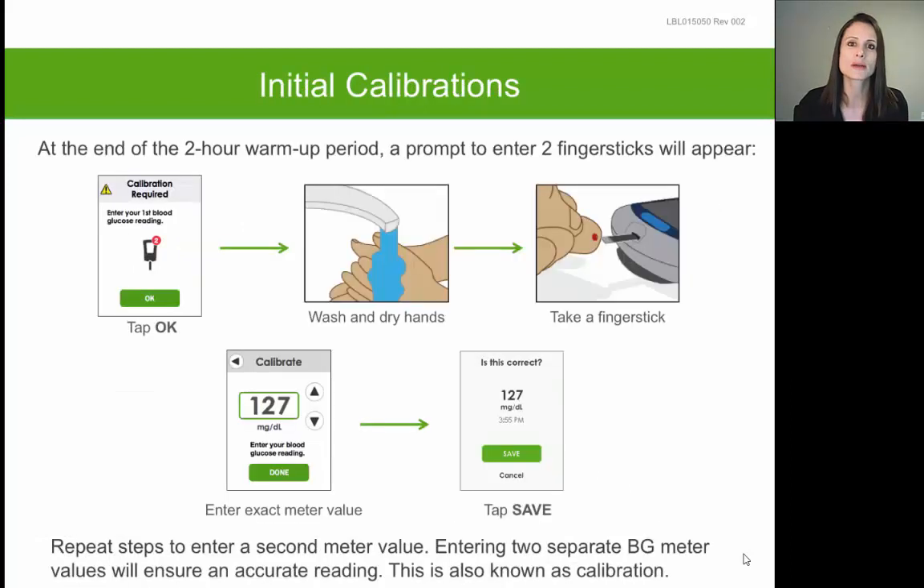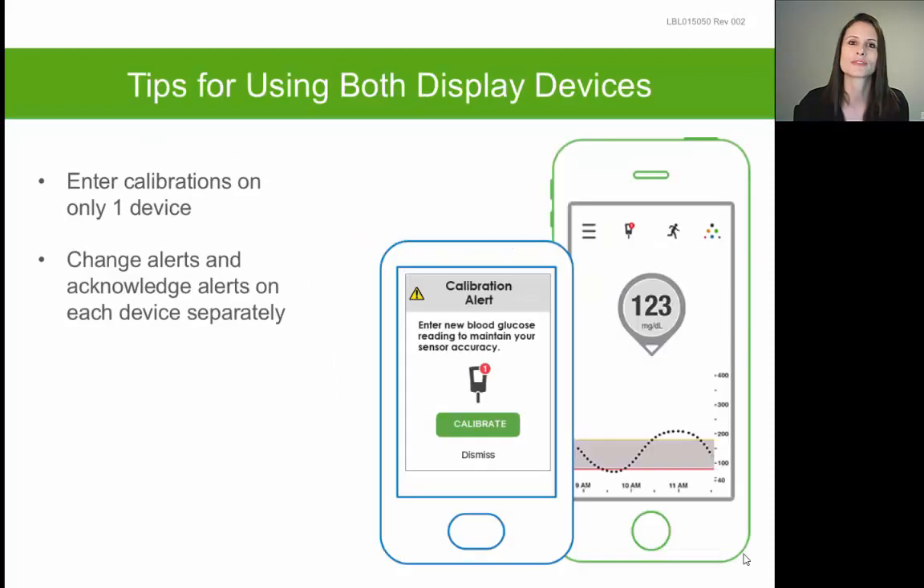At the completion of the two-hour warm-up, it will ask you to perform your first two calibrations. Calibrating means you check a finger stick on your glucometer and manually enter it into your receiver. You have to perform two consecutive calibrations at the completion of the warm-up. To do this, tap OK on the calibration prompt, check a finger stick, and manually enter it into your receiver, then repeat that process a second time. Once you enter those first two calibrations, your receiver will display a glucose reading on the home screen. You need to continue calibrating your Dexcom once every 12 hours to maintain the accuracy of the system.